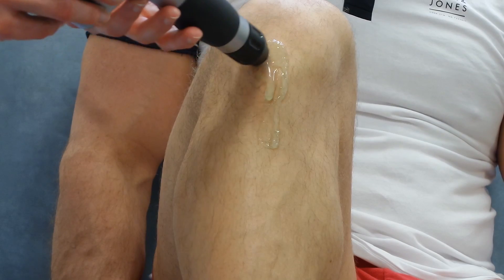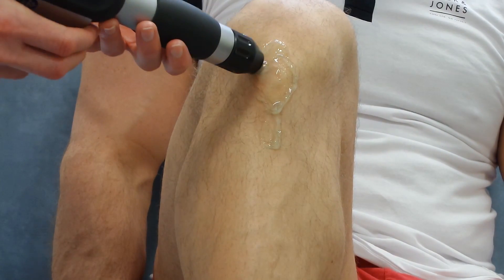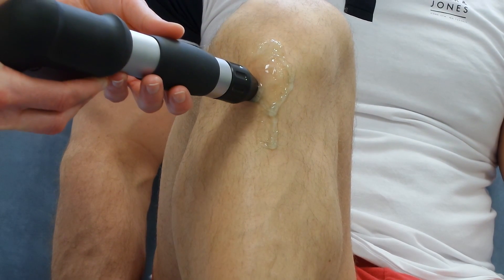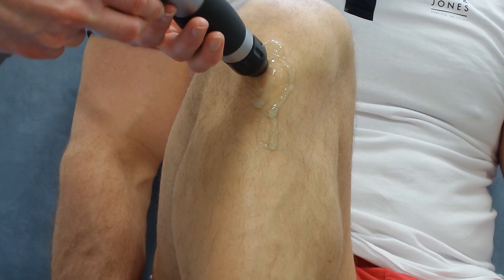The Shockwave is then brought onto the Osgood Schlatter's. It's a bony overgrowth at the end of the patella tendon, which usually comes from overuse in teenage years whilst you are still growing.